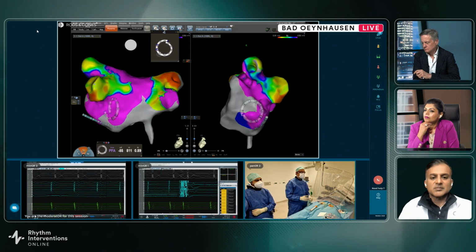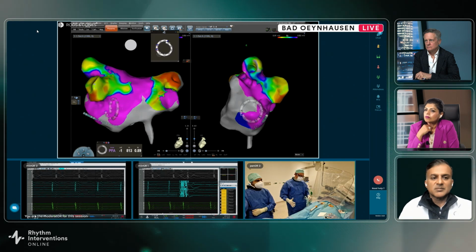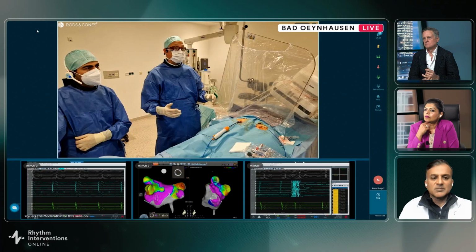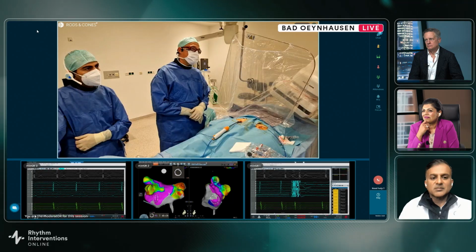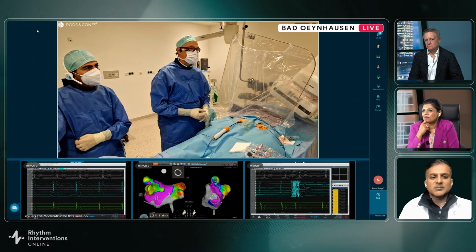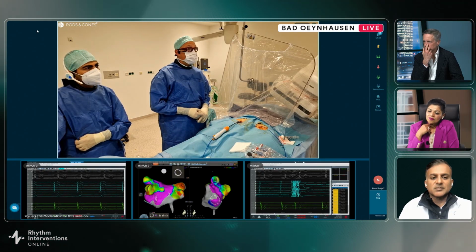I mean, when we look now, and please show us TPI and the correlation between the low voltage area, I think it's very important to still have osteal lesions. We know that we can create lesions everywhere. We discussed this already, posterior wall, whatever. But from this point of view, good catheter to tissue contact is still very important, also in terms of avoiding hemolysis, for example.